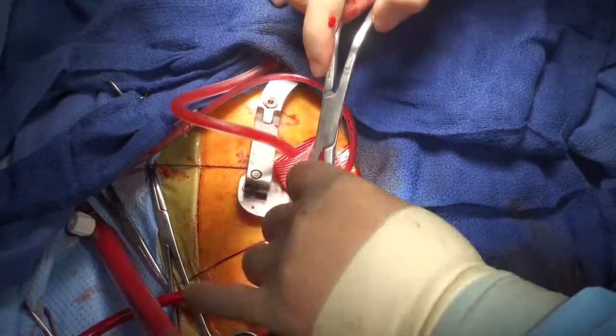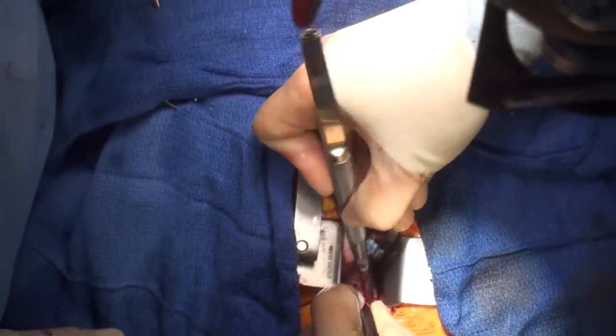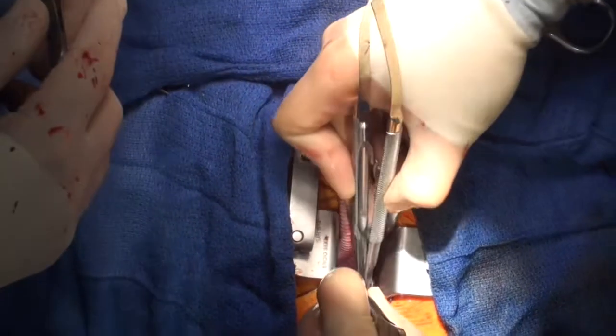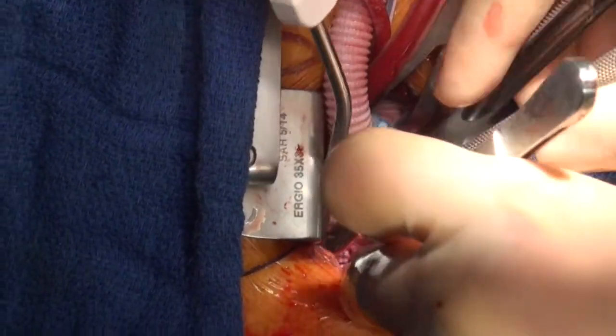The circulatory arrest time — with cerebral perfusion — was only about 17 minutes. We've now recommenced bypass. Flow has been returned to the patient and warming has been commenced.